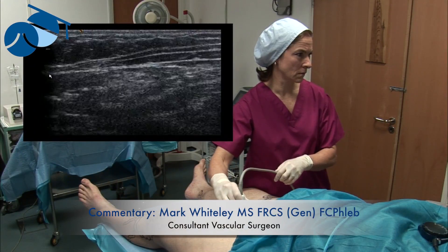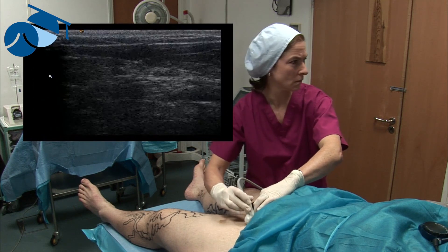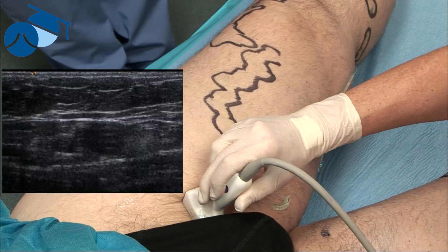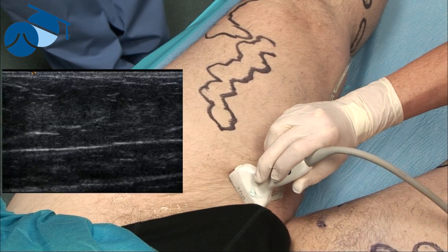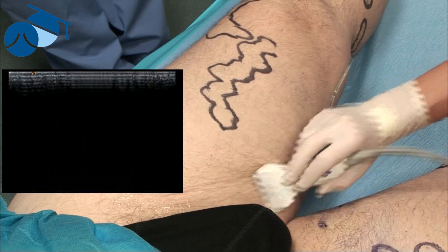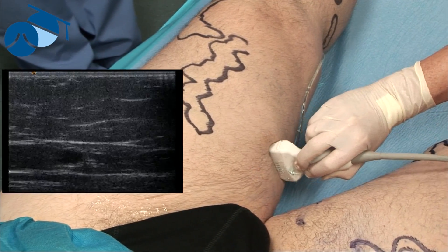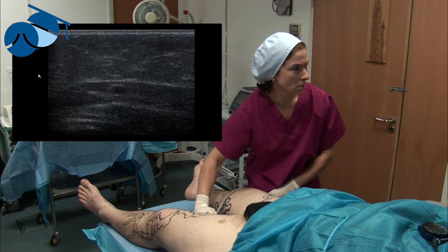Here we're going to do a quick preliminary scan down the great saphenous vein on the left side. Before we mark it fully, we're just finding the great saphenous vein in the groin — the sapheno-femoral junction. There's a large anterior accessory saphenous vein exiting to the lateral side. On the right, the great saphenous vein continues down inside the fascia, and at this point there's a tributary coming off. The diagnostic scan suggested it might become a bit atrophic at this point.